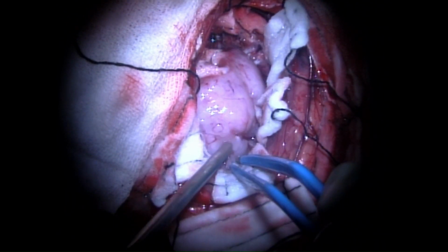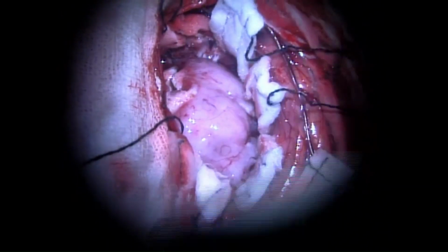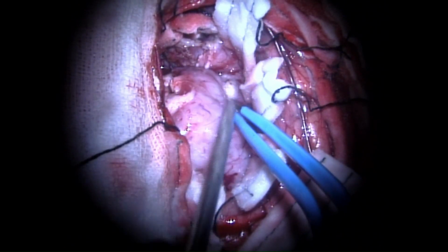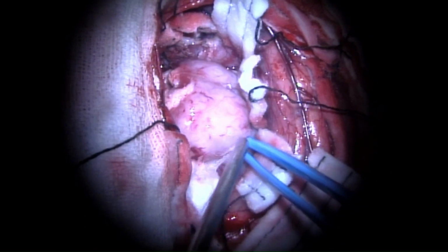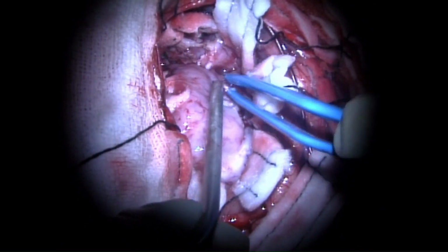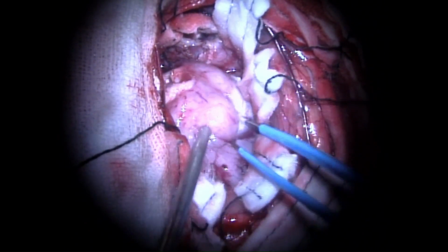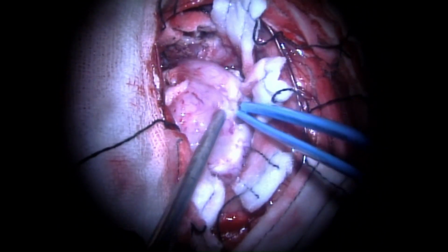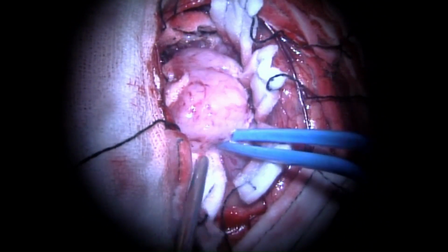After the frontotemporal craniotomy, a curvilinear opening of the dura was obtained. This was followed by the identification of the tumor, which was rather easy from the rest of the brain parenchyma. A combination of microsurgical techniques were used to gradually debulk this tumor.